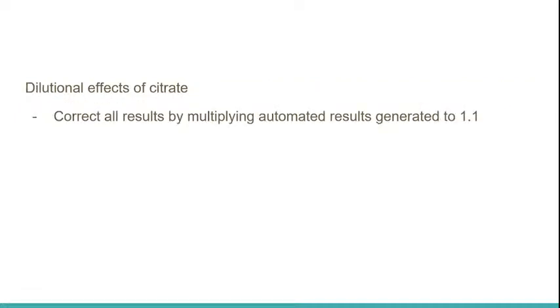All right? Because why? There is a dilutional effect. What do you mean by dilutional effect? EDTA nowadays is mass produced in crystal form. Therefore, there's no dilutional factor, and the amount is so small that it doesn't necessarily cause a dilutional effect. But a lot of sodium citrate, as for ESR and coagulation studies, oftentimes have liquid-based anticoagulants, and therefore we need to take into consideration what will happen to the sample.